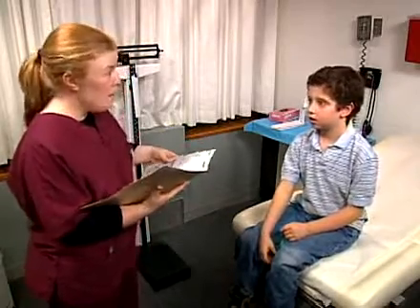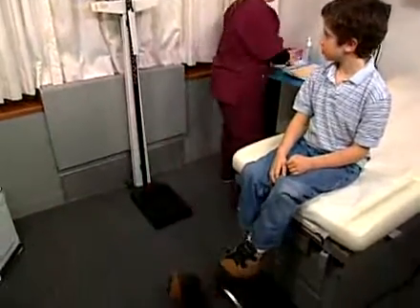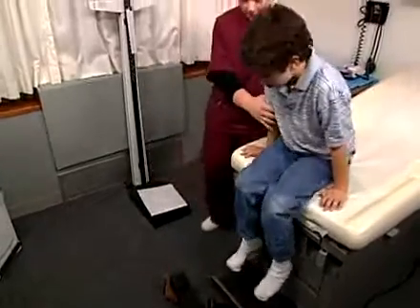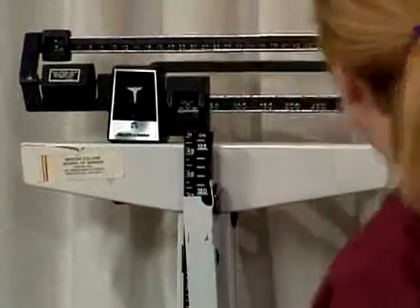Instruct the patient to remove coats and jackets, keys and shoes for a more accurate measurement. If shoes are removed, a paper towel should be placed on the scale. Some offices always weigh with shoes to save time. In either case, be consistent from patient to patient and visit to visit.